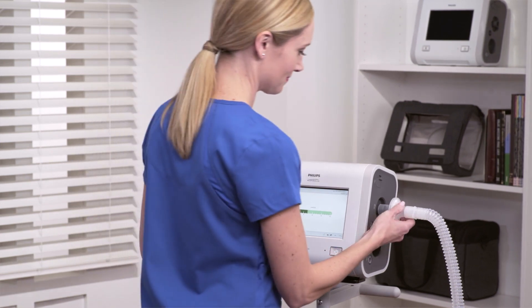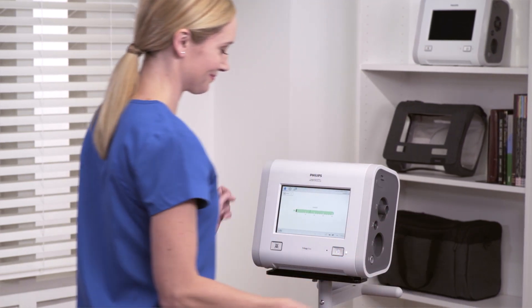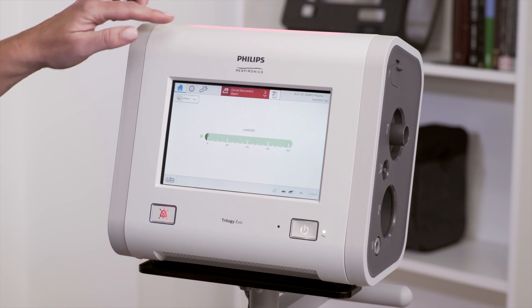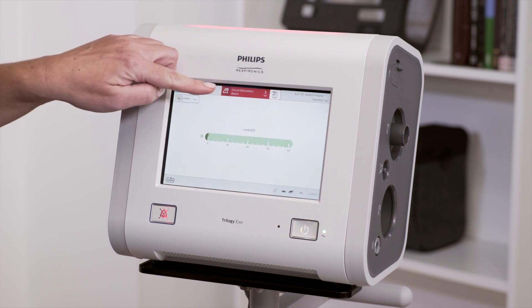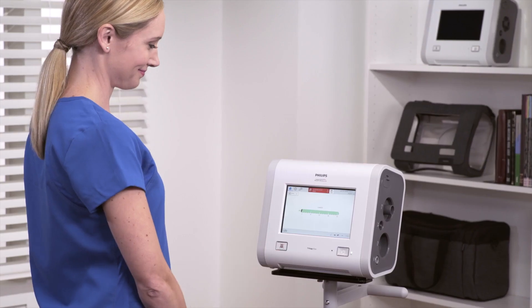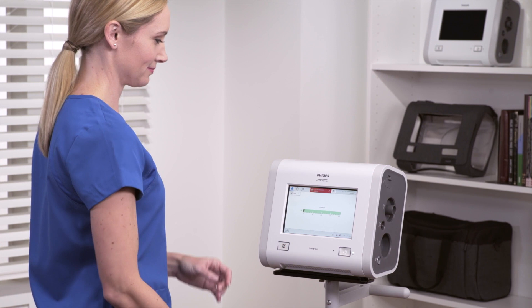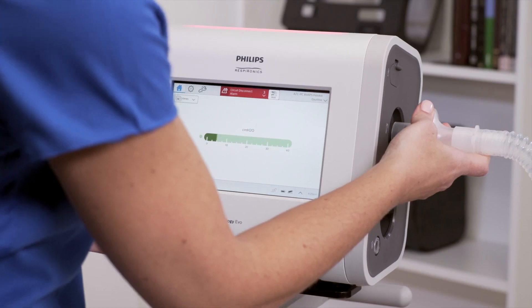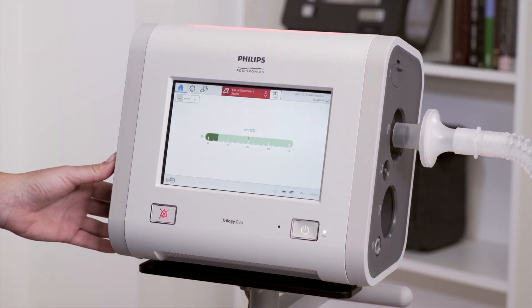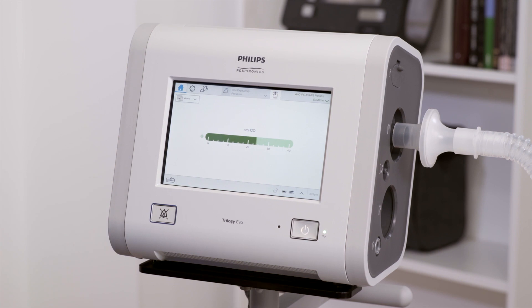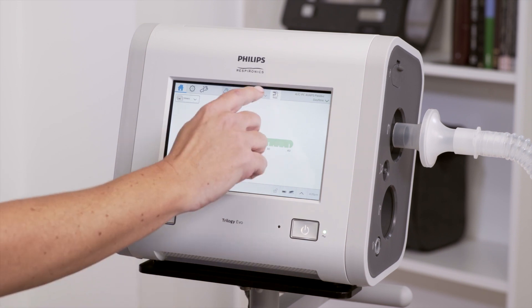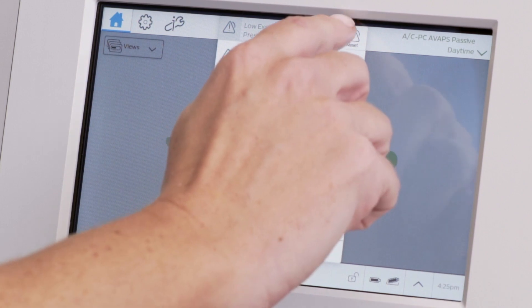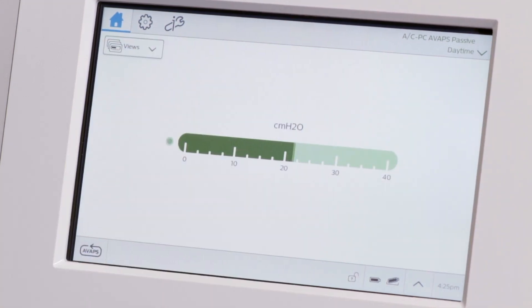If the circuit becomes disconnected during ventilation, you will see high-priority indicators. In this instance, connect the circuit to resolve the alarm condition. To learn more about the alarm, tap the Alarm List. Since the alarm has resolved, you can tap the Alarm Reset icon.